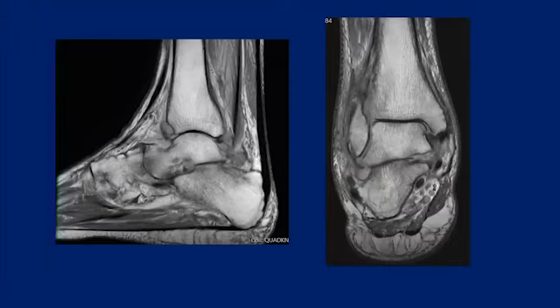There is severe, diffuse, uniform thinning of articular cartilage. You can see both the ankle and the subtalar joints are fairly equally affected. There is synovitis both in the ankle and posterior subtalar joint recesses, and there is actual fusion across the midfoot.